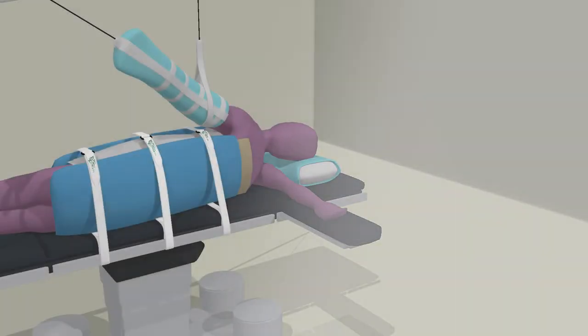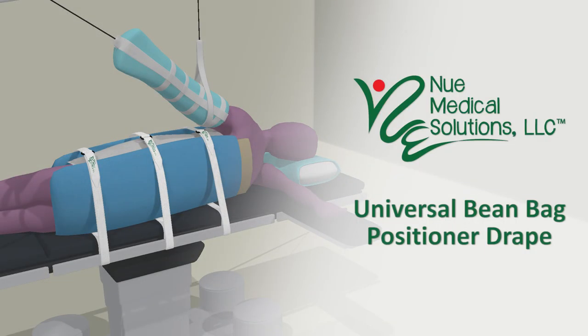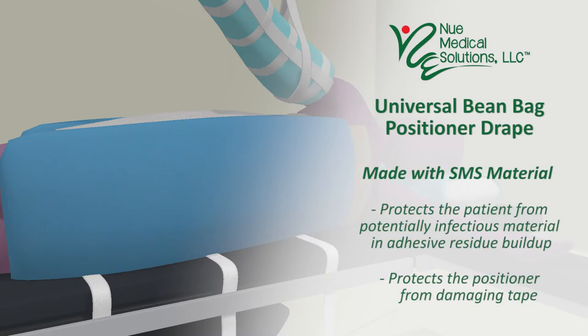Our universal beanbag positioner drape has many advantages. SMS material protects the patient from potentially infectious material from adhesive residue buildup on the surface of the reusable beanbag positioner, while also protecting the positioner from damaging tape.